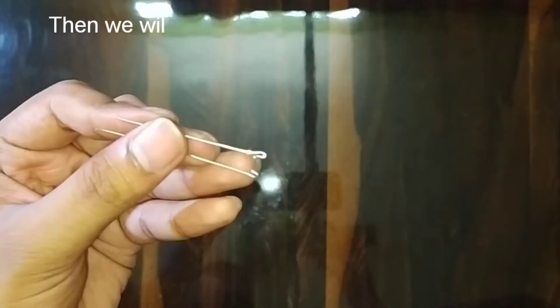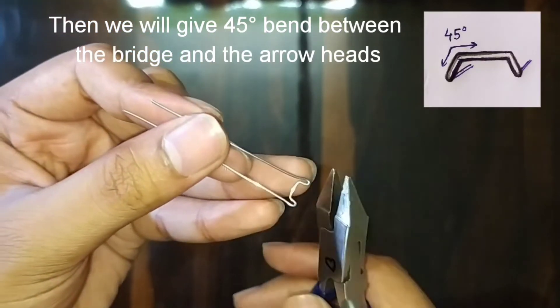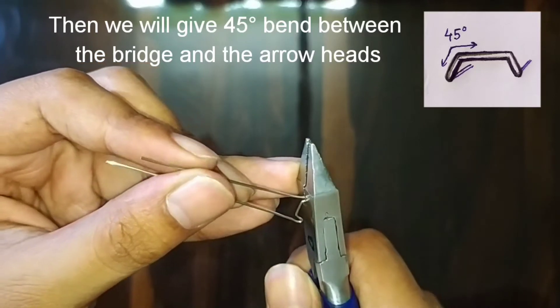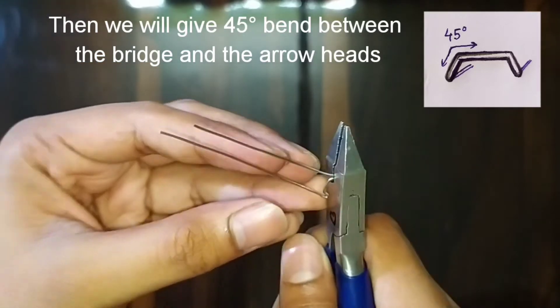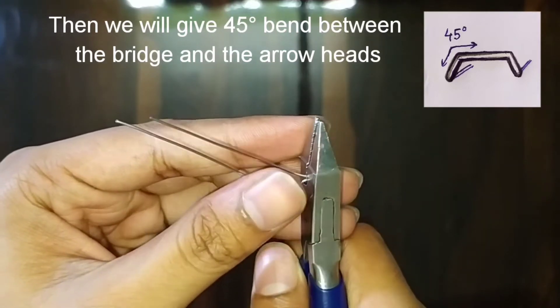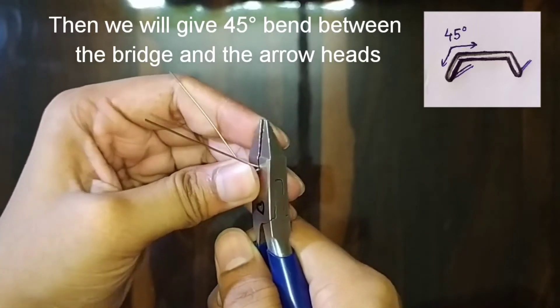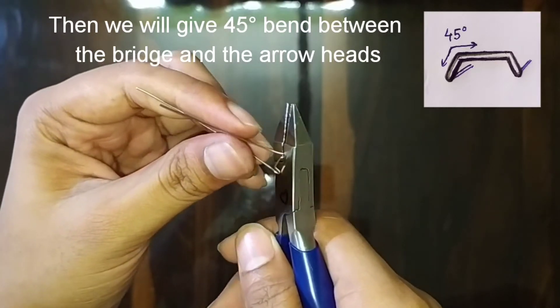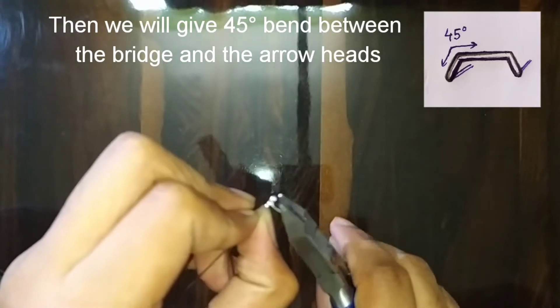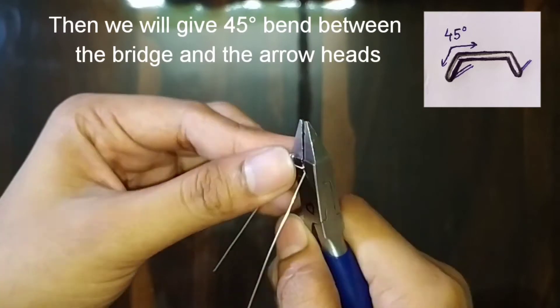It's okay if you don't do that. Then we will give a 45-degree bend from the bridge to the arrowheads as shown in the figure. Hold the arrowhead from the corner of the Adams plier and apply pressure on the remaining portion of the bridge with the thumb to give the bend. Do similarly on the other side too.